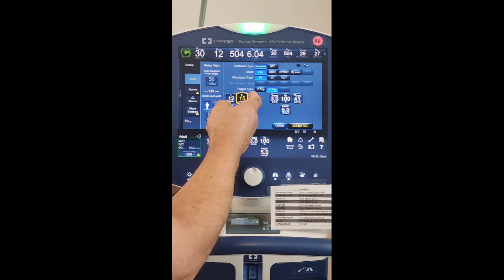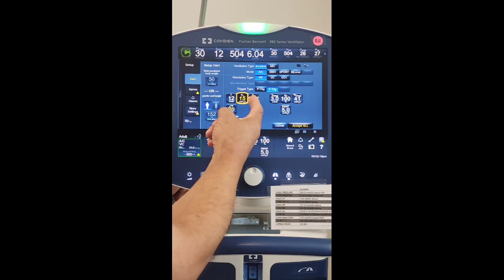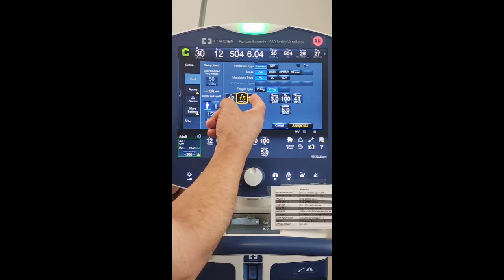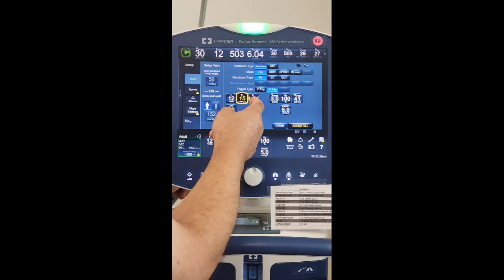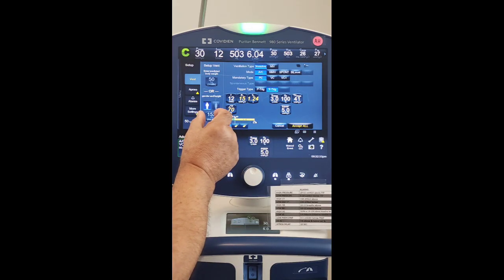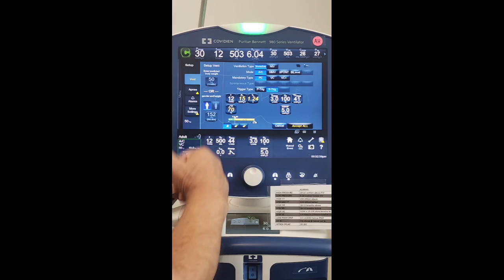That's what you're going to use to adjust your IE ratio, making your I time longer. You would have to make this time longer, okay? If you're going to make your I time shorter, your IE ratio shorter than 1 to 3, make it 1 to 2, we're going to have to shrink the I time to reduce that I time on there.